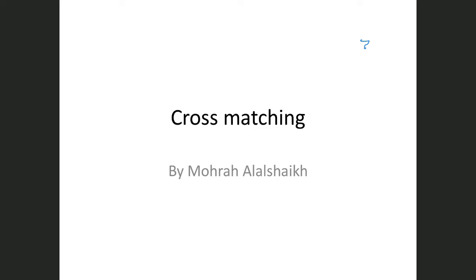ABO typing. So excellent. So we have ABO compatibility. We have the antibody screening test, and if it's positive, we have to do antibody identification. Then we have to do cross matching.